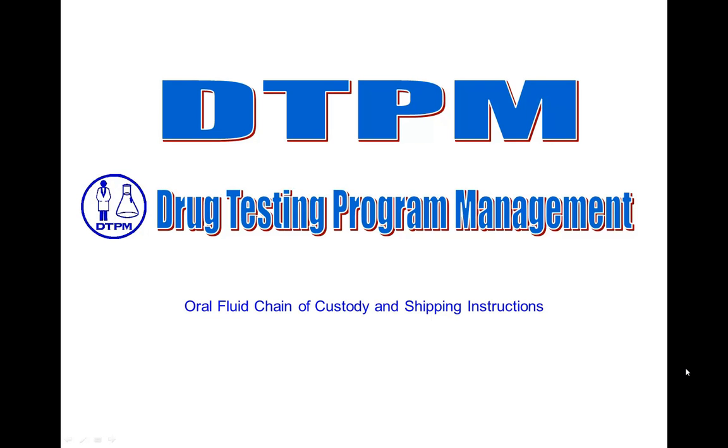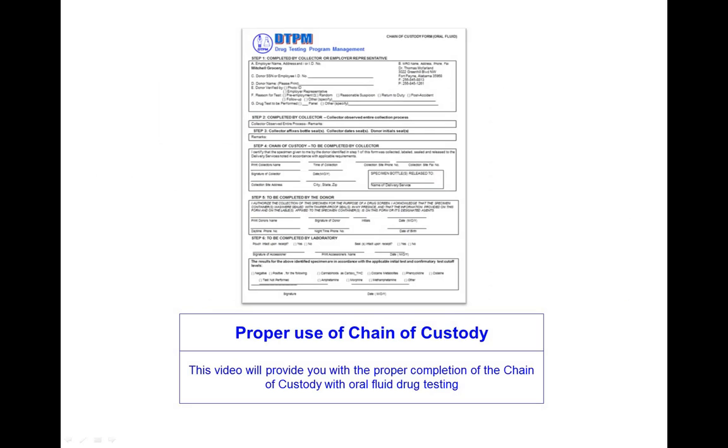Welcome to DTPM's video series, Oral Fluid Chain of Custody and Shipping Instructions. Proper use of chain of custody. This video will provide you with the proper completion of the chain of custody with oral fluid drug testing.